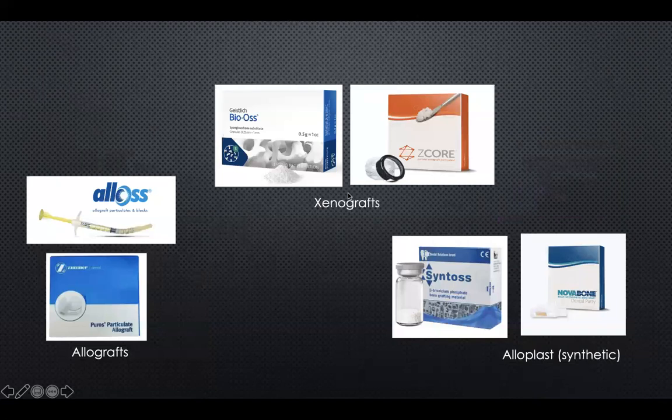What about bone graft? Again, many options from autogenous bone grafts, which is bone graft that is removed in blocks or scraped from the jaw bone of the patient. Or we have xenogenic material from porcine or a bovine bone, or we have allografts taken from cadavers, or we have synthetic material or what's called alloplast.